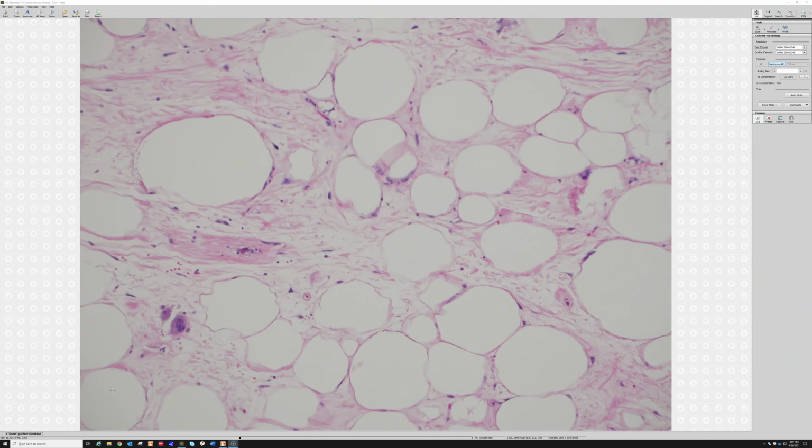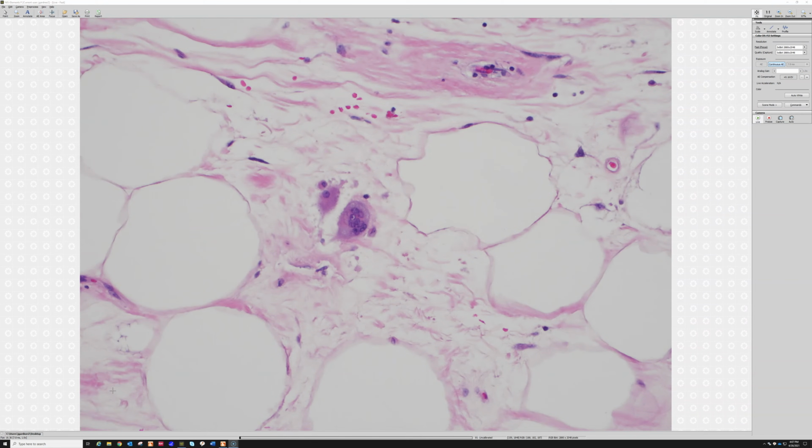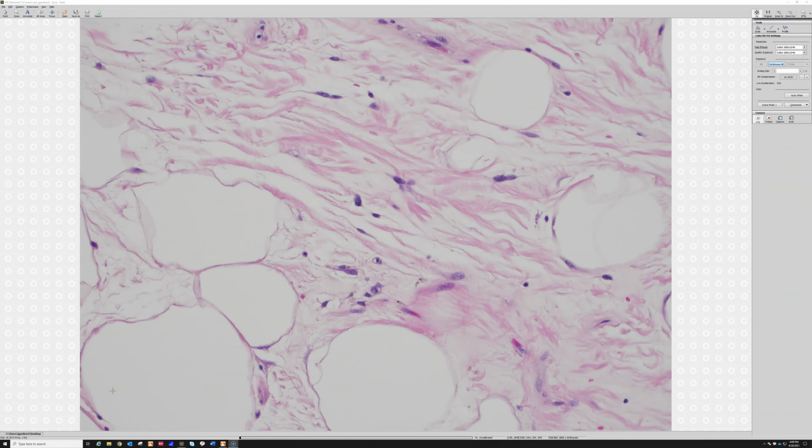So, again, a very characteristic example. And oh, there, right there's some multinucleated cells. Those are histiocytes right there. That's just fat necrosis, this little pocket right here. So if I just had that, I'd say, no, that's just fat necrosis. But it does take a little practice, so I encourage you, look down below.